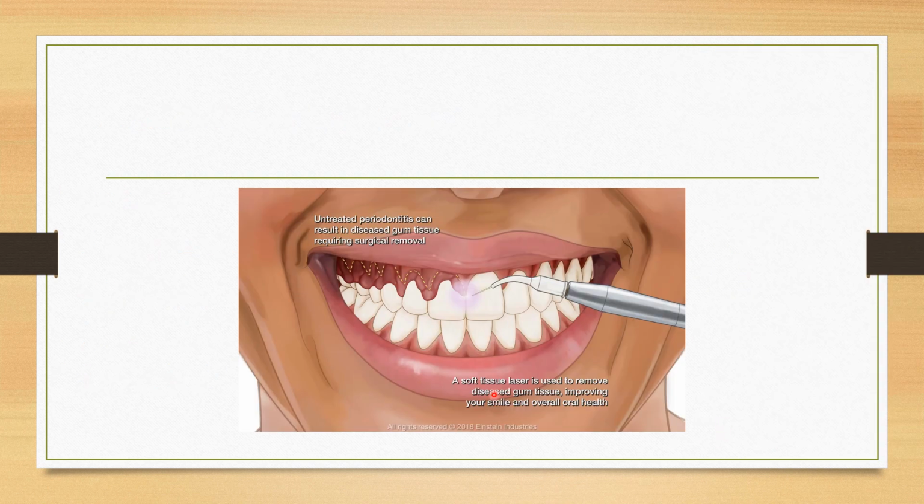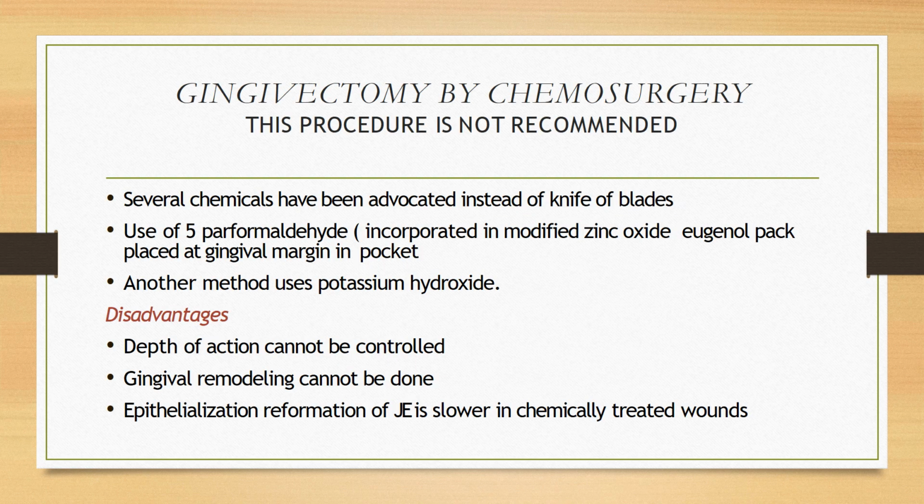So this is just the diagrammatic representation. We are doing cases in the department on a daily basis, so you can come and assist individually, to see the cases and understand how it is being done. You can see what postoperative instructions are given, what the result is, and what the satisfaction level of the patient is after laser gingivectomy.